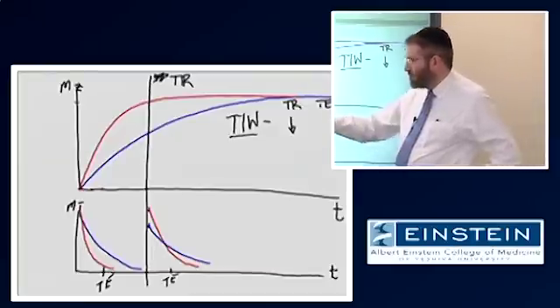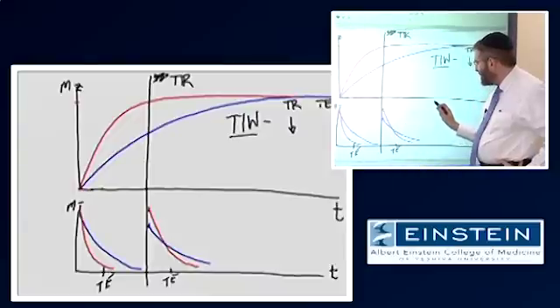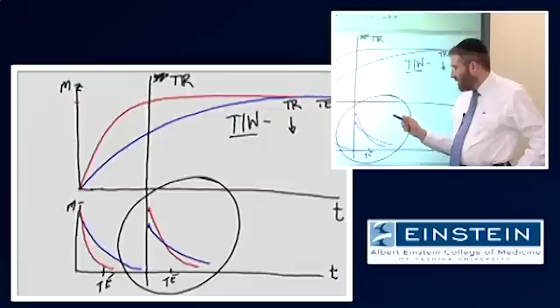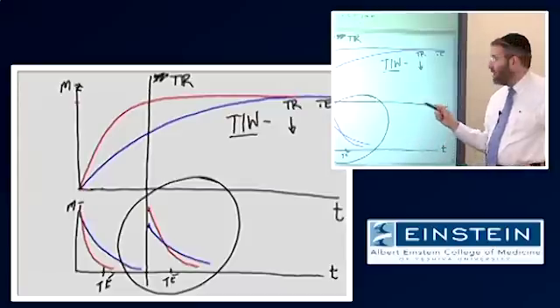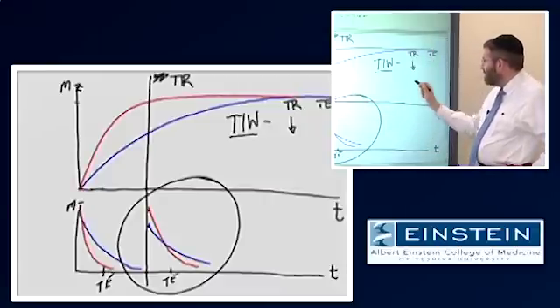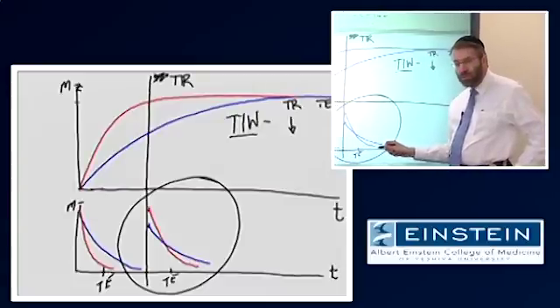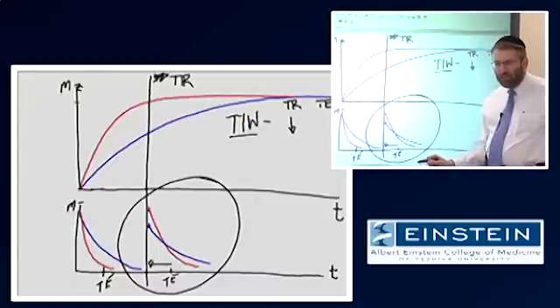This is all one image, all one process. This is our starting point. Let's not even talk about an image, when we measure this signal, if we want it to show us maximal differences between these two tissues based on T1, we want to make this TR very short. At the same time, to make that image as exclusively a function of T1 differences as possible, we want to minimize anything occurring due to T2 relaxation. So we will make our TE as short as possible.